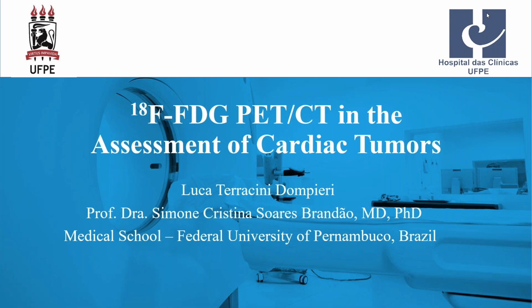And it's such an honor to be here. I'm grateful. It's an amazing opportunity for me as a student to be part of this webinar and present my work here for such an audience. And so I'll begin the presentation called the FDG PET CT in the assessment of cardiac tumors.